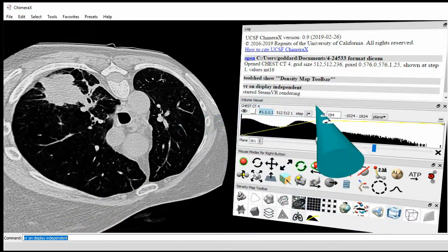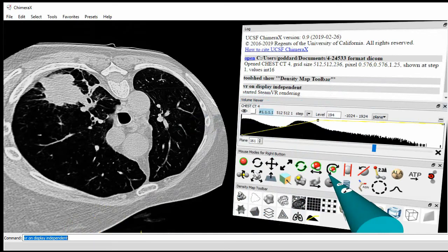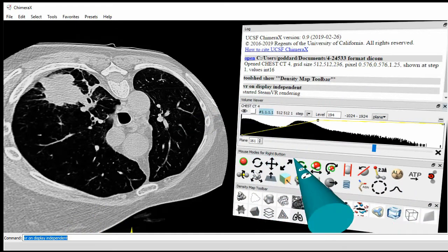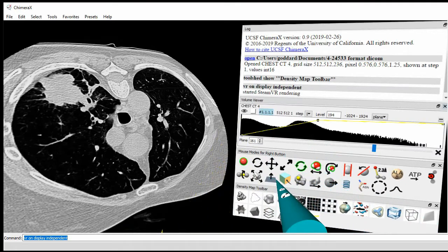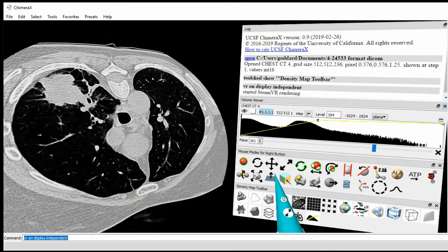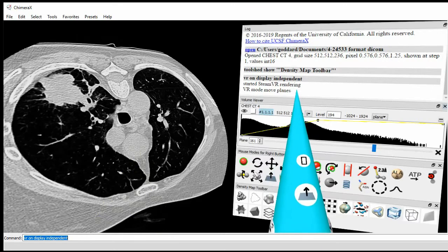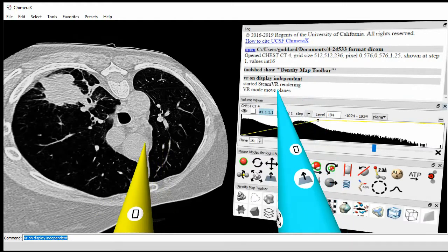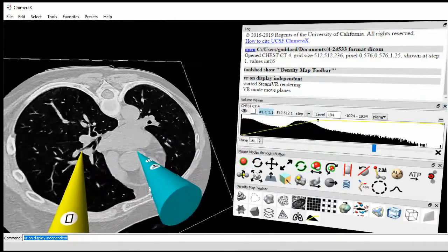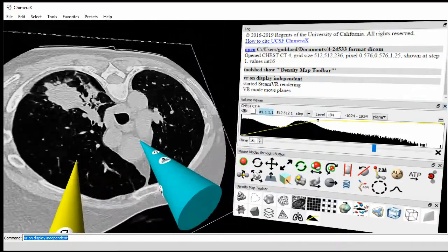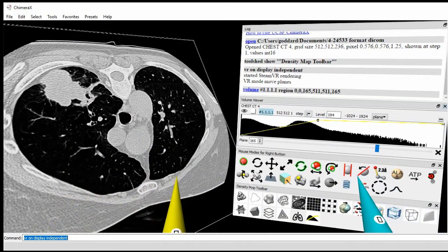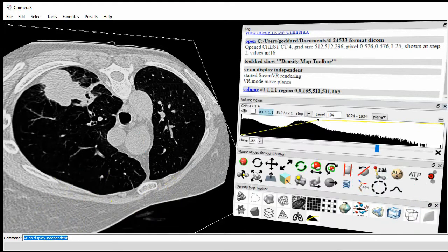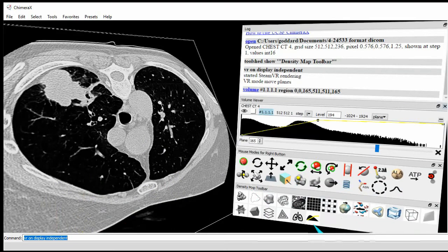Let's slice through the different planes. On the user interface, I have these icons, the ones that say mouse modes. These are things that can be assigned to the hand controllers. This gray square with the arrow will allow me to move through different planes. I'm going to click on the thumb button, the trackpad on the Vive controller. It changes the icon to that icon. Pressing that button allows me to move through the different slices of the data. This is just like I did with the slider with the mouse. Of course, we're in virtual reality and the main benefit here is I have very good depth perception. I want to look at 3D regions of the data.